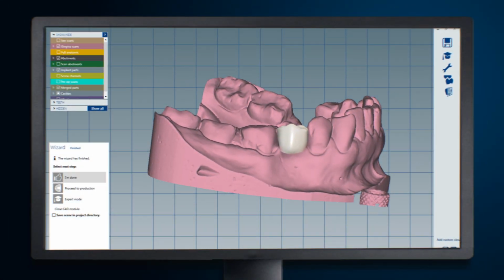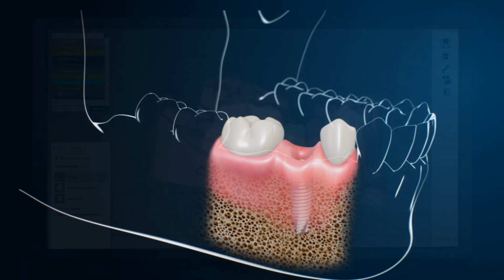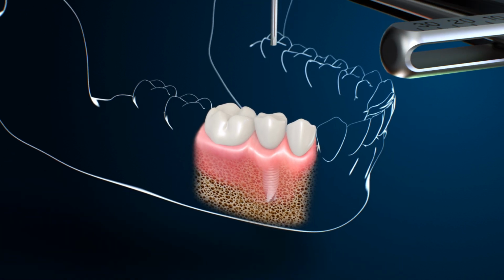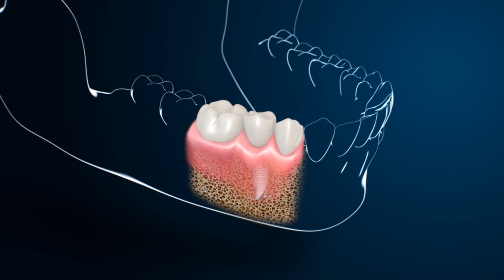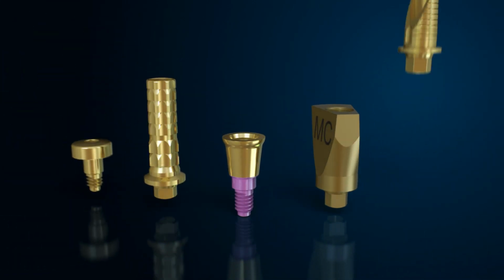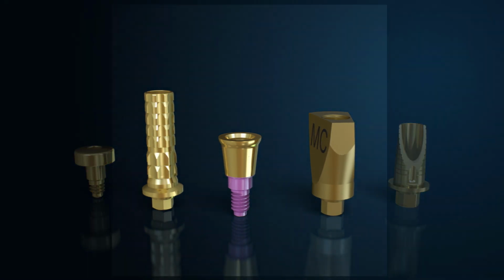The path of insertion of the MISConnect abutment is convenient for use also with bridge restorations. With its unique narrow profile, a predictable and successful outcome is easily achieved. The solution allows for a broader range of screw-retained prosthetics and may be used in 1- or 2-stage procedures.